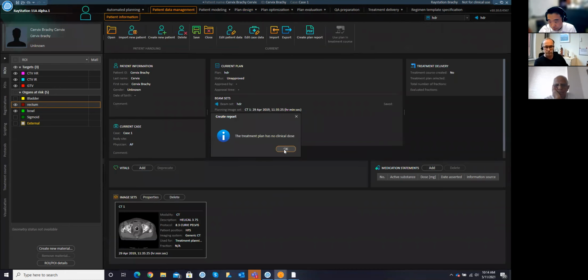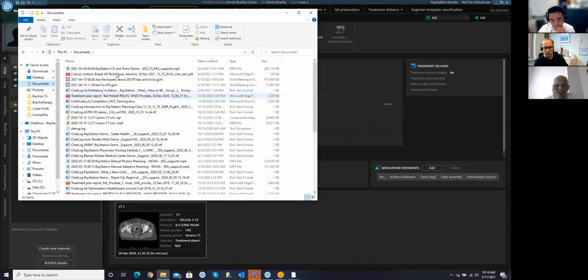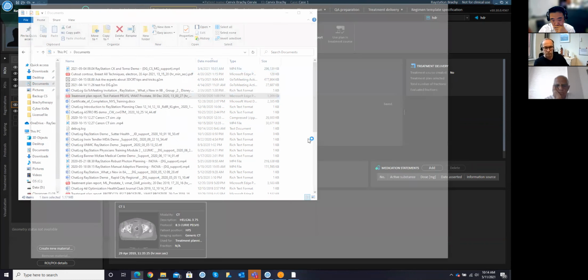Regarding the question about the afterloader, we currently have support for BEBIG, and we're working on the others. We have quite a number of customers that are using Elekta equipment. So that's what we are focusing on now, to make sure we can get that connection to the afterloader to work, and to make sure we can plan for that.